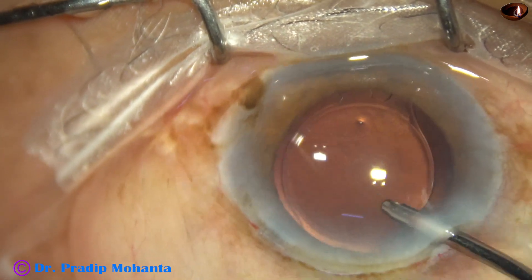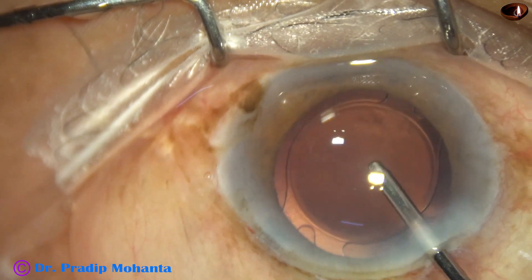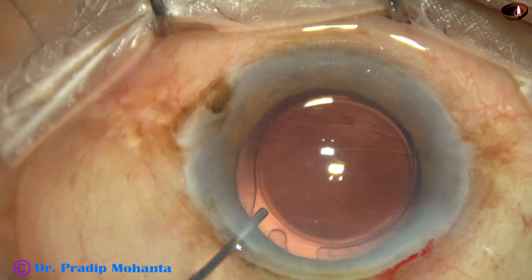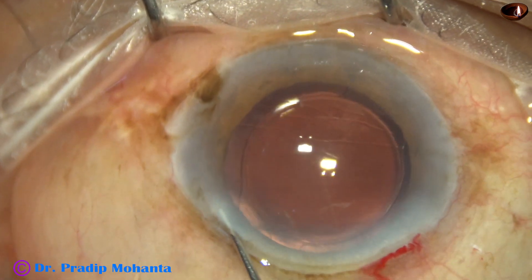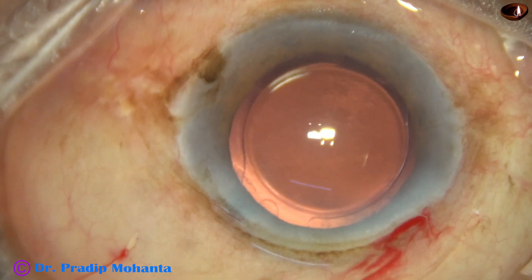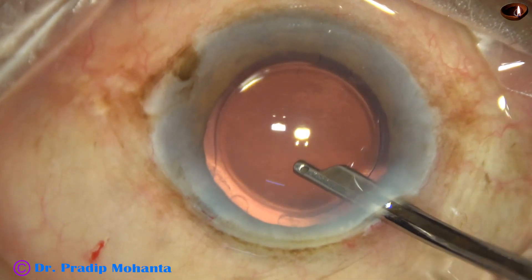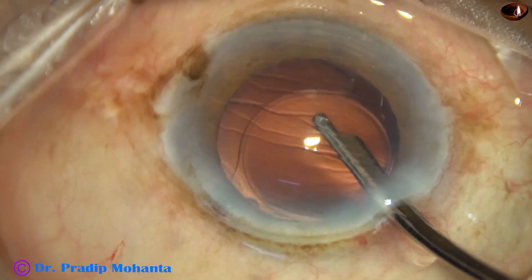So, we have managed a case — a 97-year-old man with very hard cataract, and the patient is hard of hearing, but he can move around and manage his own life. We are towards the end of the surgery. The side port is closed, and then the final lavage is done with a 27-gauge Simcoe cannula.